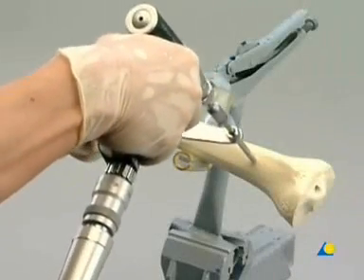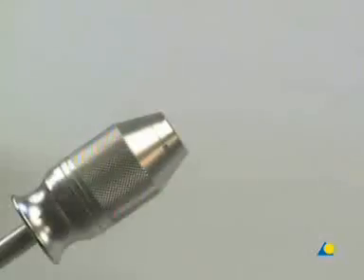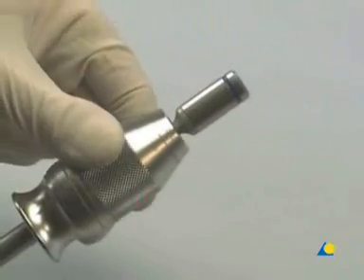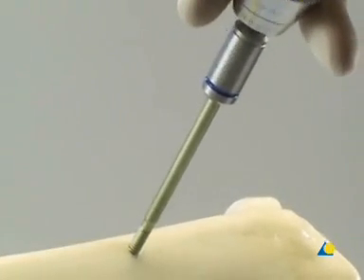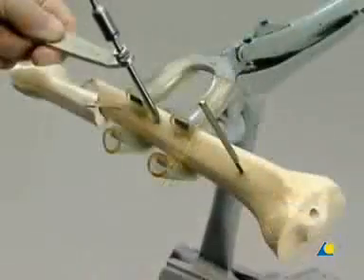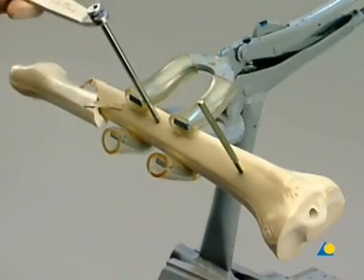As an alternative, the power drive is used only to insert the Schanz screw through the near cortex, and the universal chuck with T-handle is mounted onto the Schanz screw. The Schanz screw is then advanced by hand until it is anchored in the far cortex. The remaining Schanz screws are then inserted again with the power drive.